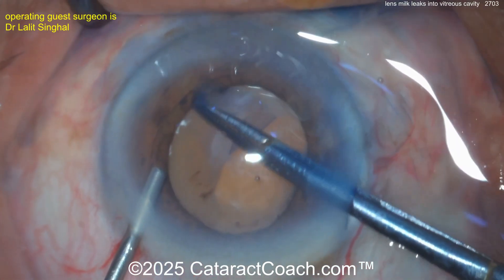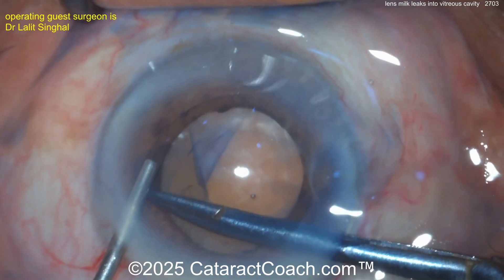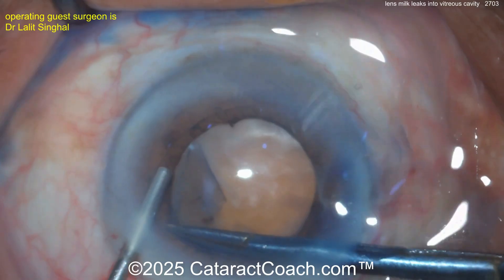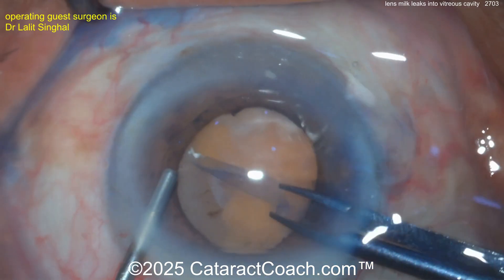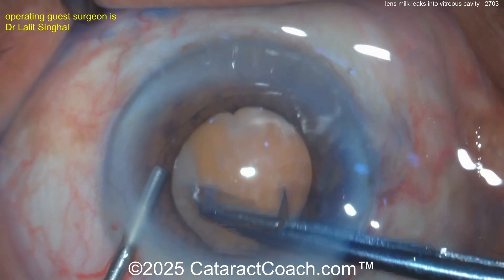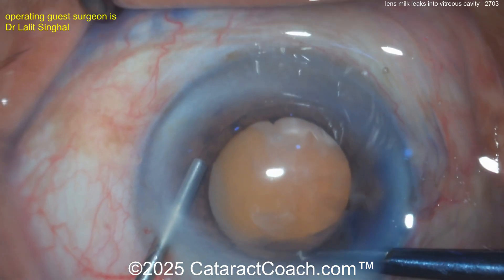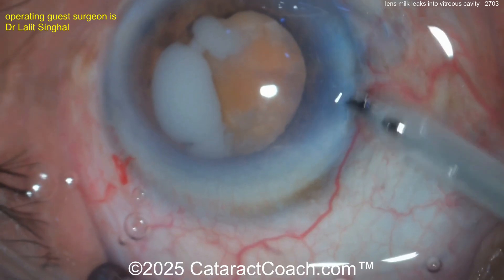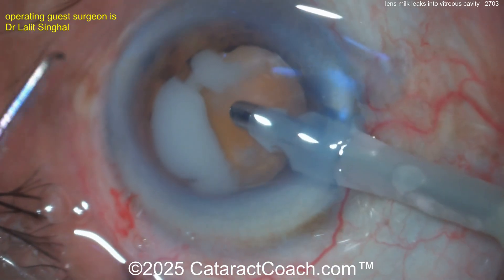Good control by the surgeon here, completing a nice five-millimeter capsulorhexis — that looks great. Everything looks pretty normal; I don't notice any zonulopathy or weak zonular support, and the surgeon is able to get a good-looking rhexis done. But the question is: how is this liquefied lens material going to seep out of the capsular bag and into the vitreous?